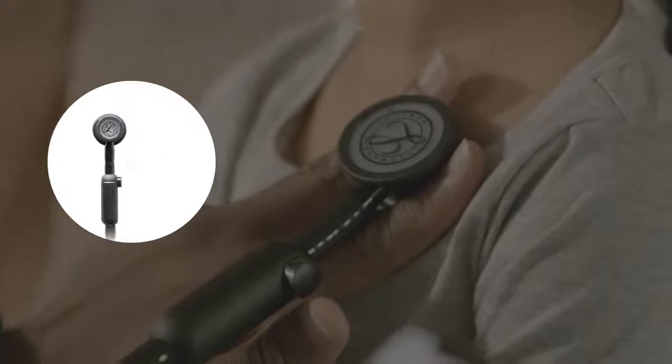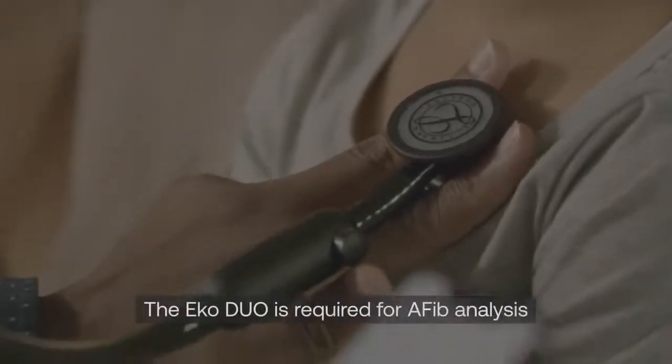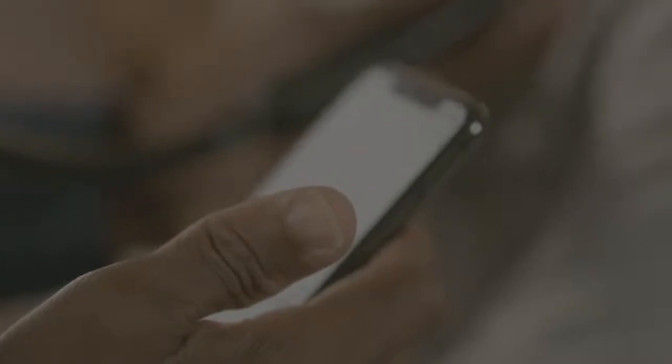All your data are stored securely and accessible through the mobile app and connected dashboard. You can also upgrade to the Pro plan to use Echo AI analysis algorithms to help detect heart murmurs and AFib, or to the Pro Telehealth plan for AI-powered live stream auscultation with integrated video conferencing.